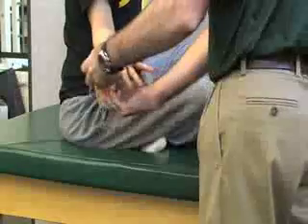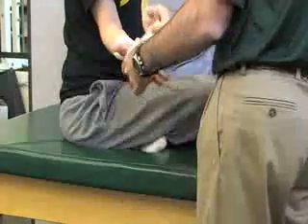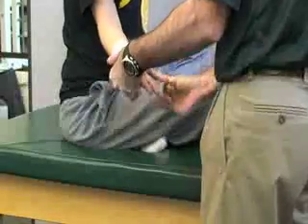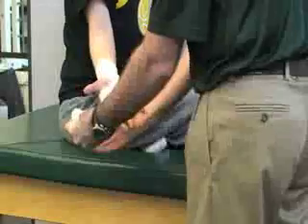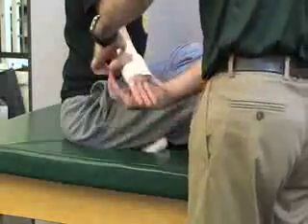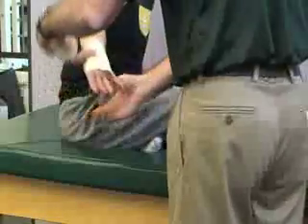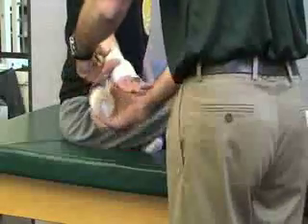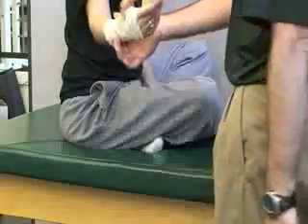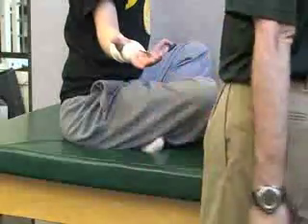Have her spread her fingers again, being careful not to pinch the thumb. When you're done, you can optionally do a figure eight — some people find this a little bit helpful. Then close on the forearm. Throughout the whole process, ask the athlete if it's too tight. When finished, check functionality by having her hyperextend and hyperflex, then check circulation and sensation. If it's tight in the thumb, you can cut a small slit there.